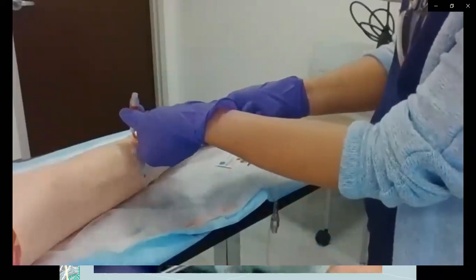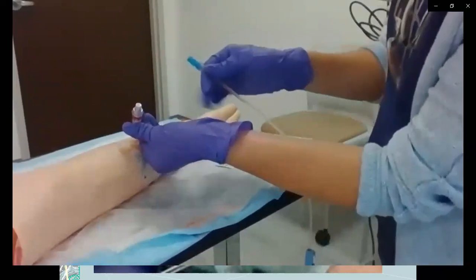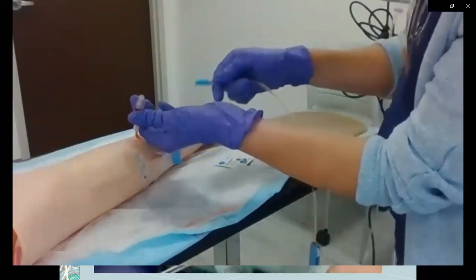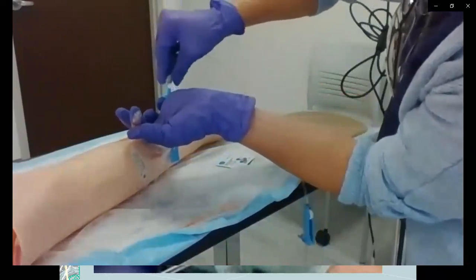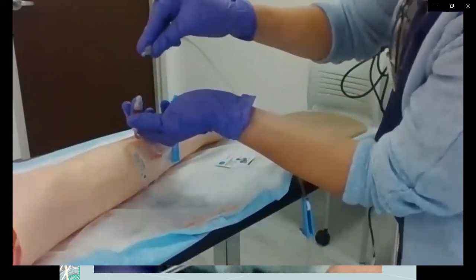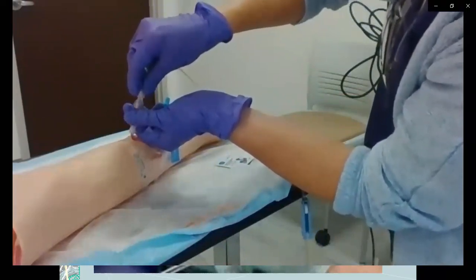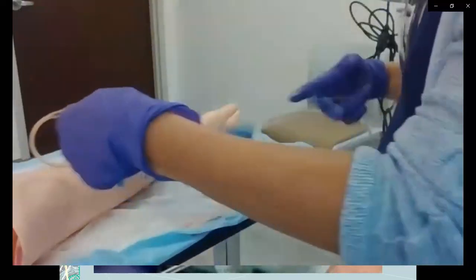Again, maintaining aseptic technique. I'm trying to turn this so that you can see my hands, the way you do this with just your two hands. I've got two fingers holding this hub so it doesn't fall down and get dirty again, right? Then with the rest of my hand, I'm going to use my pinky and twist off this cap without contaminating this tip. You're going to be using every single finger for different things. And then just like we did up there, we make sure that we connect them without touching anything else. And now it's connected.